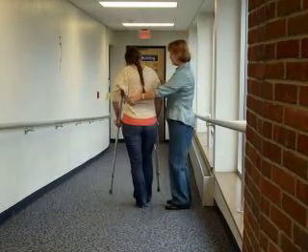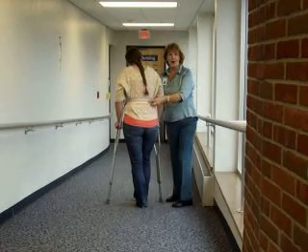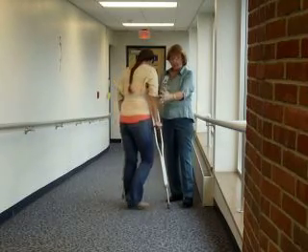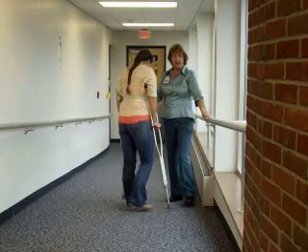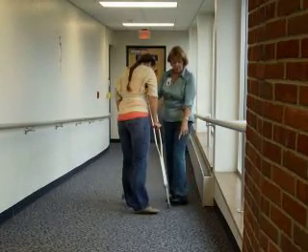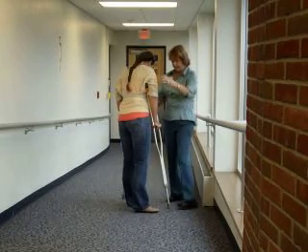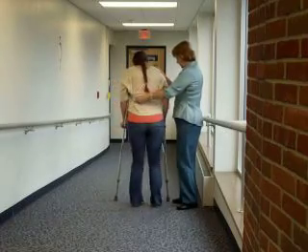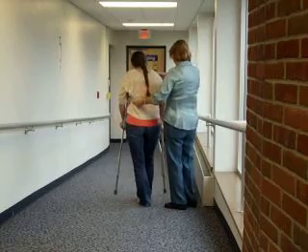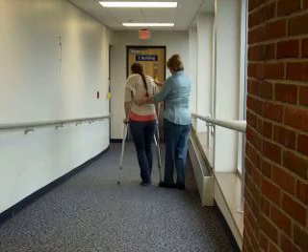Now her strong arm is what's going to be able to stop her. The reason we don't want her turned at the same angle as the others — picture a long leg cast. If she had a long leg cast turned that way, you could get caught up on that upper part of the leg. So that's a way to remember it as well. Let's turn the upper leg so she has lots of clearance for her sore foot. Go ahead and go the rest of the way down. A little more angled on the crutches. Nice one.